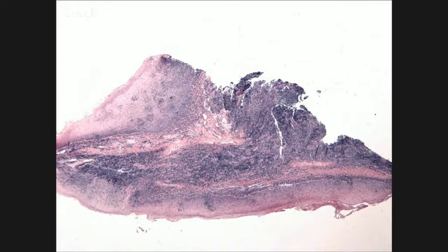And remember, this is Waldeyer's ring. Waldeyer's ring is an extranodal lymphoid tissue. So look at all the lymphoid component here. When you look at this at low magnification, the surface epithelium is bland, and there's nothing here that suggests an invasive cancer, which goes back to what we talked about, the absence of desmoplastic response, or maybe more of an inflammatory response.